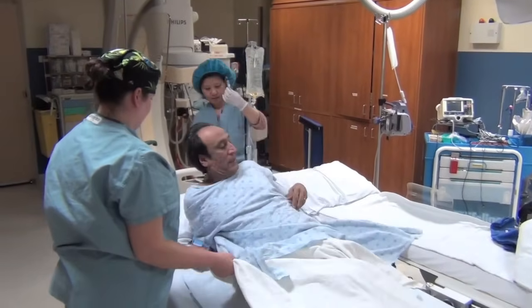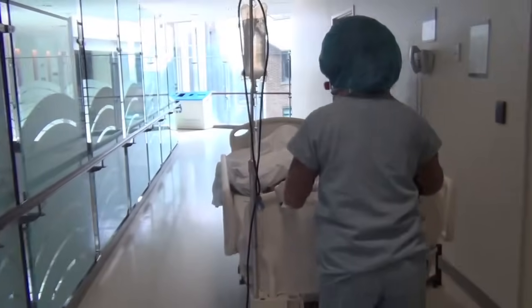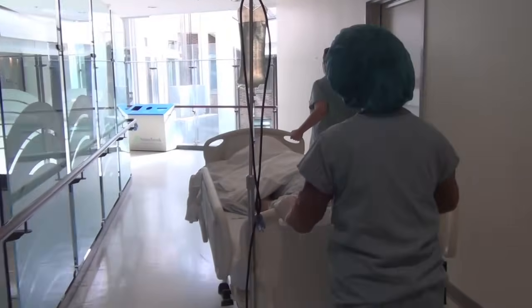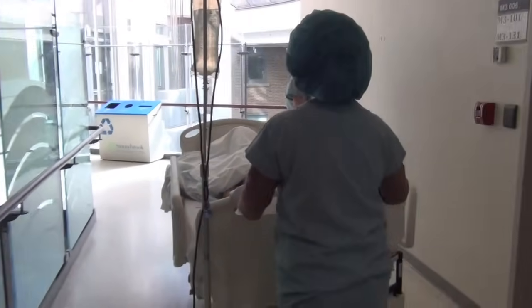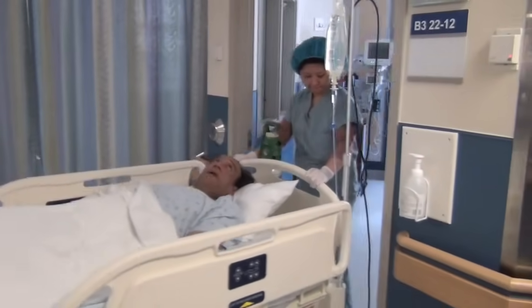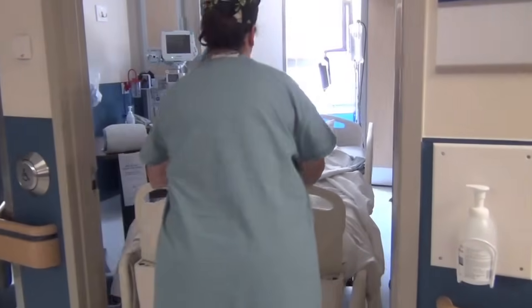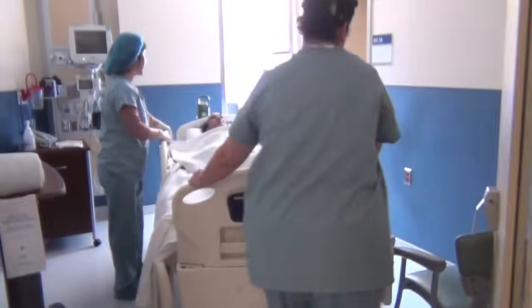Once all the equipment is removed, the patient is taken off the procedure table and returned to what we call the short stay unit. He may go home later the same day, or in this case — because it was already later in the day — he'll probably stay overnight and go home the following morning. We usually arrange follow-up with your own cardiologist, who might be here at Sunnybrook or somewhere else. We make sure that you have all the information about prescriptions, because some of the medications after these procedures are quite important.